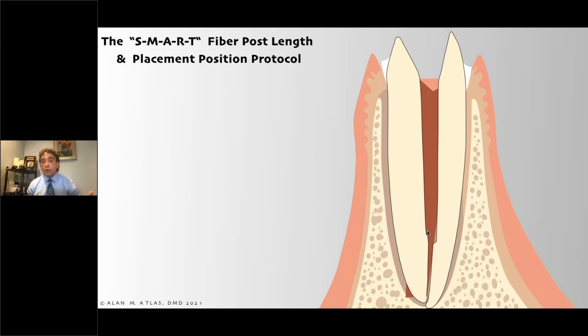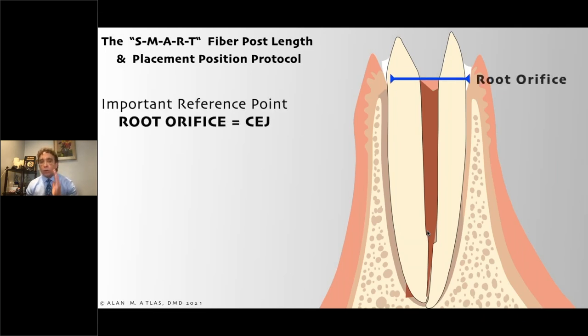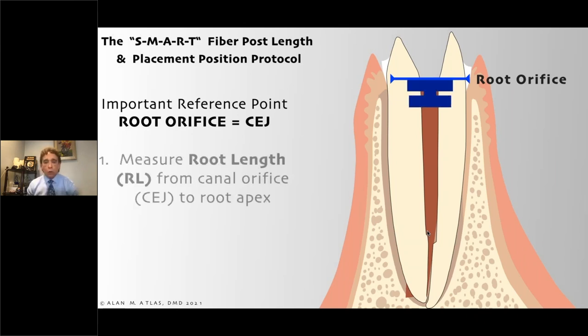You know, we can guess. Well, I can go halfway down. Are you going to go halfway down? You need to know because you're going to be doing this at obturation. So what you're going to do is, again, use this reference point, the root orifice. It's going to be the easiest way. I'm not going to use the osseous level, and again, I'll get into that a little later.